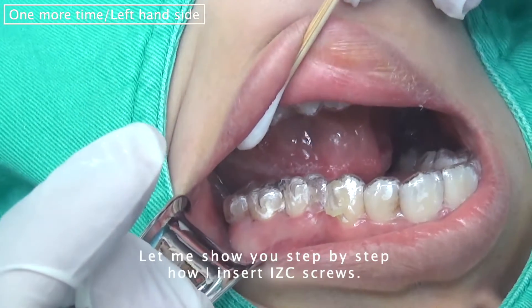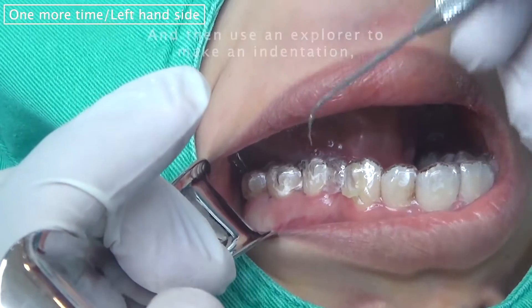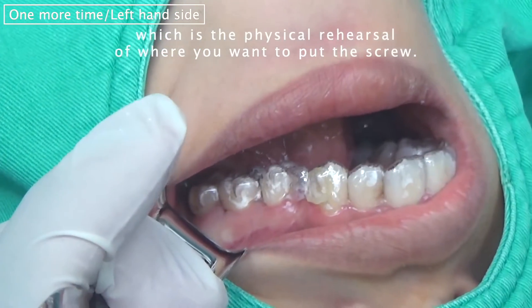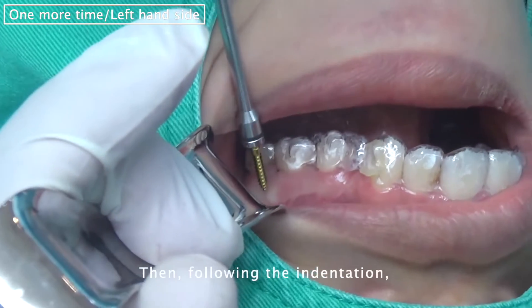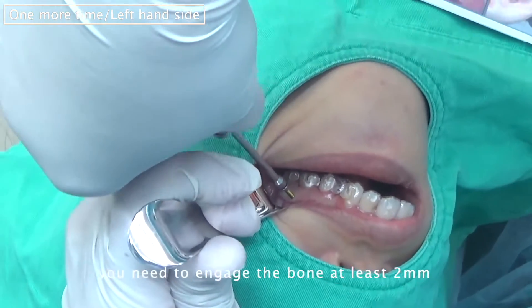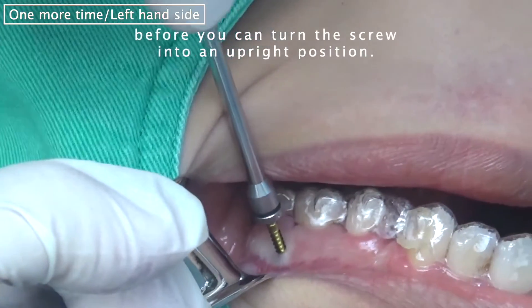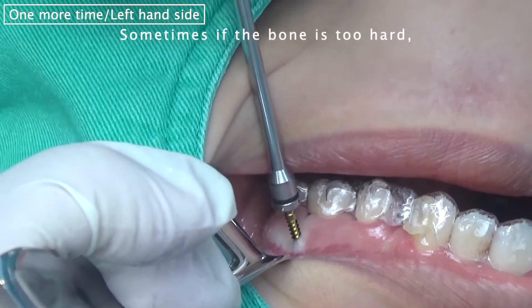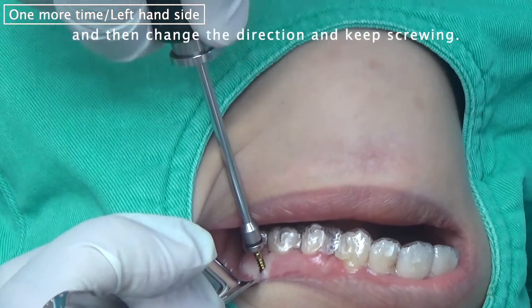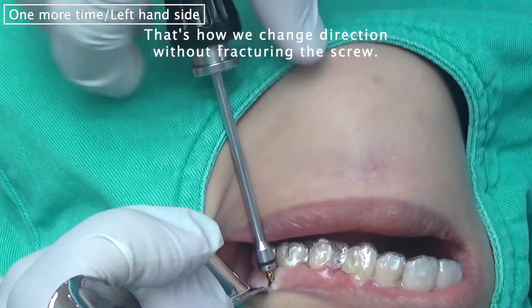Let me show you step by step how I put the IZC screw. First, you use cotton to clean the surface, then you use an explorer to make an indentation, which is a physical rehearsal for where you want to put the screw. Follow the indentation and engage the bone at least two millimeters before you turn the screw to the upright position. Sometimes if the bone is too hard, you can back up a little bit, then change the direction and keep screwing. That's how we change direction without fracturing the screw.